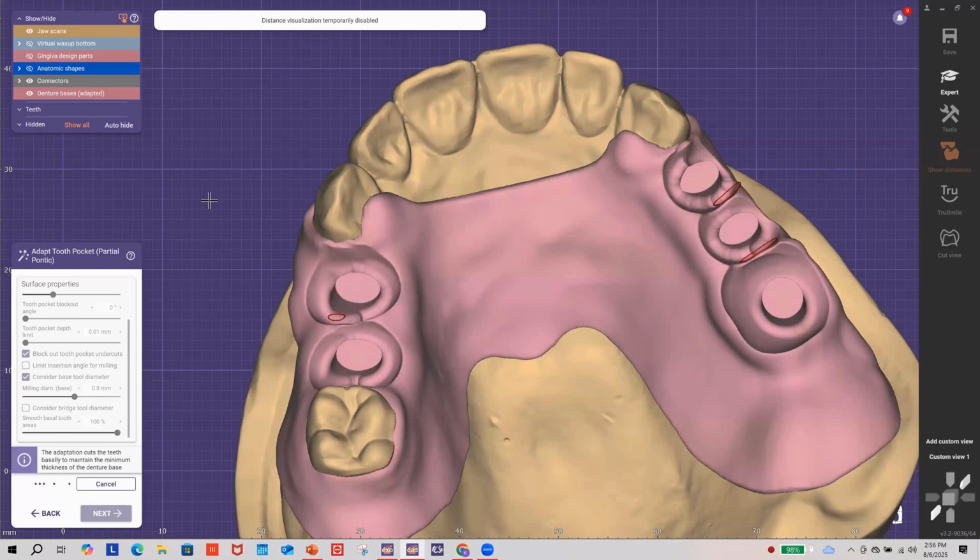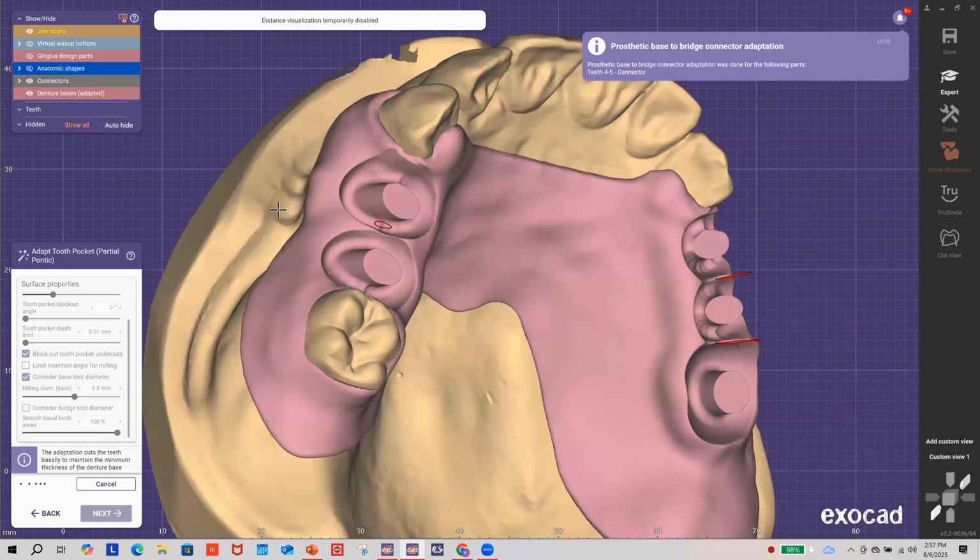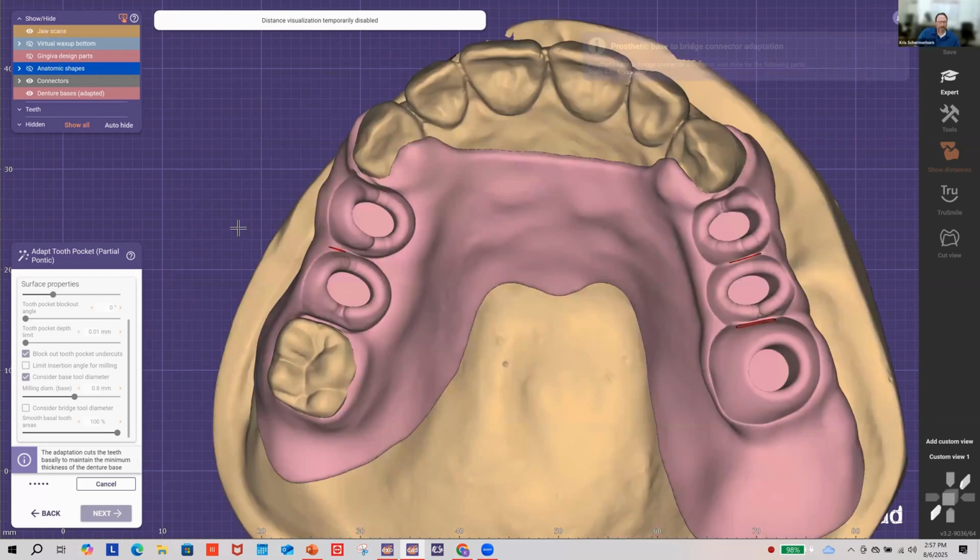And I think we do have a question here. All right. So, one of the attendees wants to know if there'll be a session on how to post-process and finish these materials. And I would like to say yes. Yeah. So I'm actually going to talk about it a little bit here.